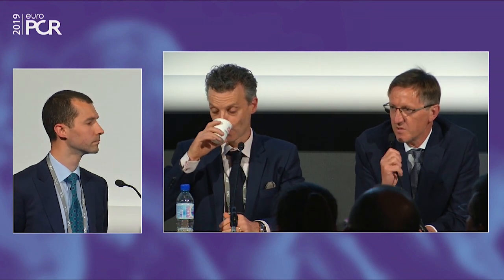The reason that you inflate the balloon is to get the fluid to work against the vessel wall. And if you have so much calcium, it will not make that much of a difference, and the balloon is not built for that pressure, because when you have a higher rated burst pressure in the balloon, there's a price to pay for crossability. So there's no need for that.